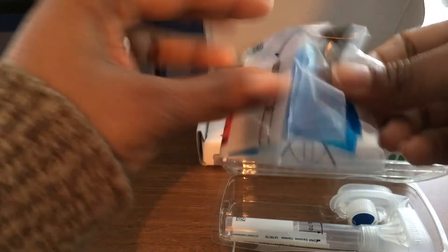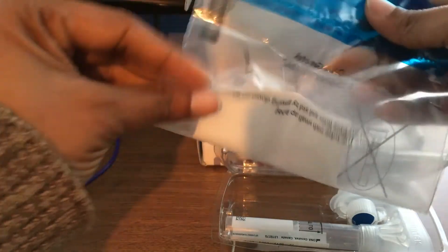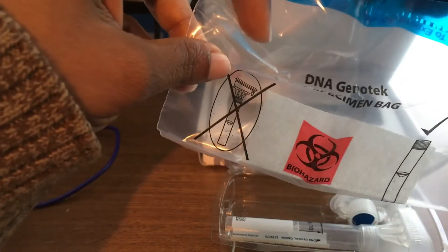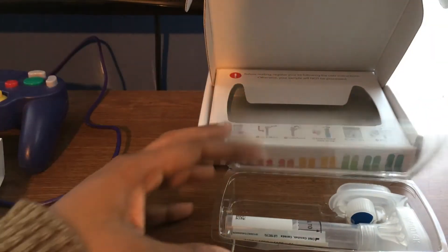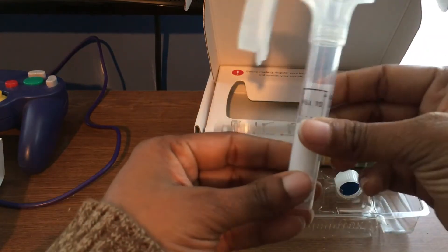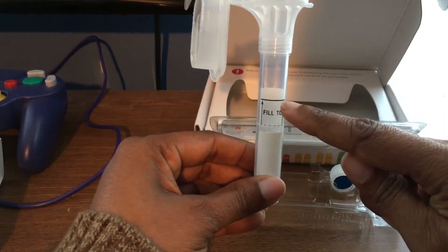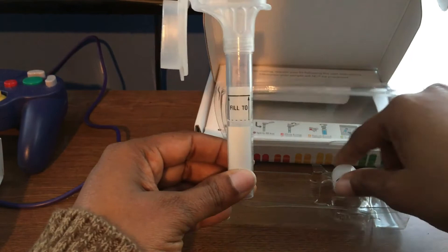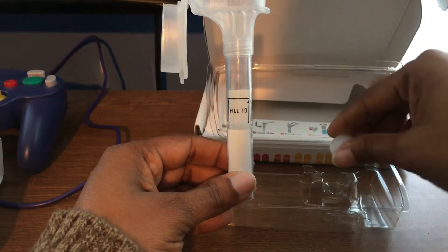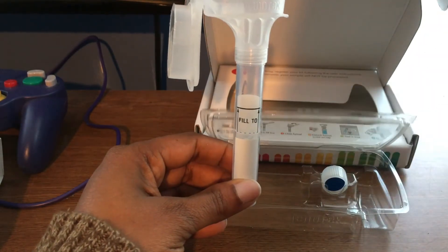You can see it has the bag — this is what you put the tube into. And here is the tube itself: you have to spit into it up to the fill line. This little cap is for sealing it afterward. I'm going to go ahead and spit into the tube until I reach the fill line.